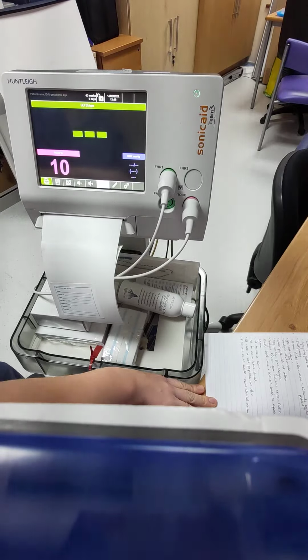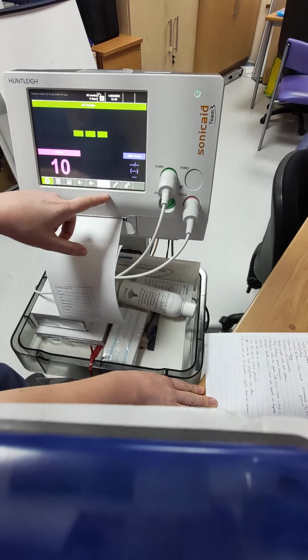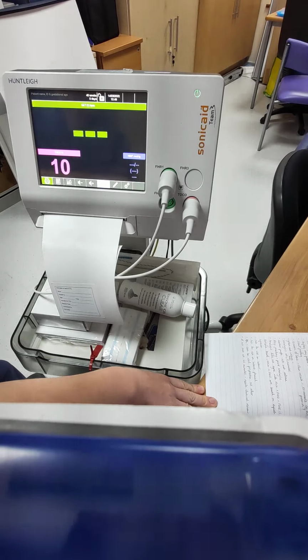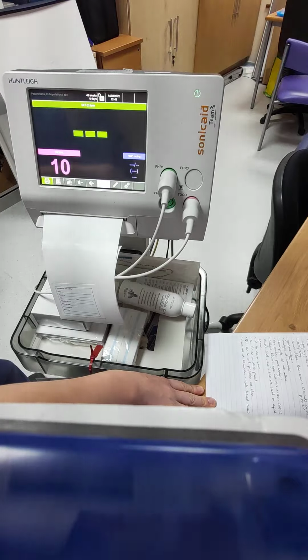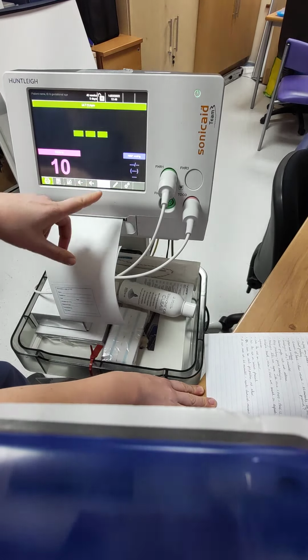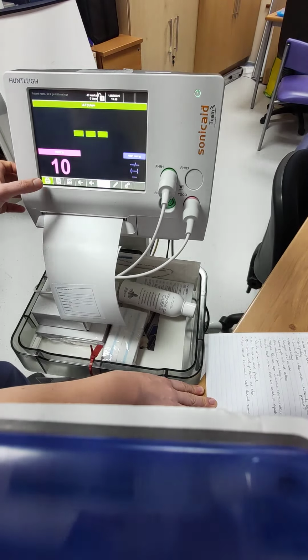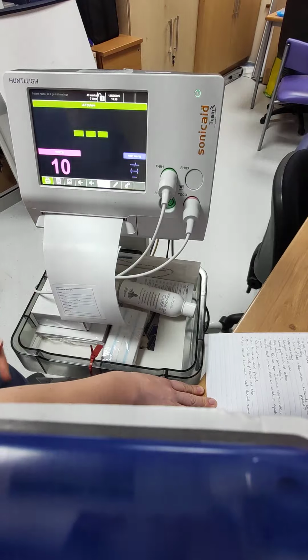It will take 10 minutes of trace and then you'll get a result. So if it turns green within 10 minutes, then it's met the Dawes-Redman criteria. Our protocol means it needs 20 minutes to meet our guidelines. And then after 10 minutes, you'll get an analysis every 2 minutes. If it goes darker purple, it means it's not yet met the criteria. If you then stop the printer, it will print out your analysis.